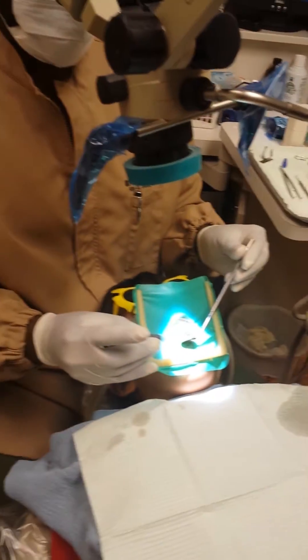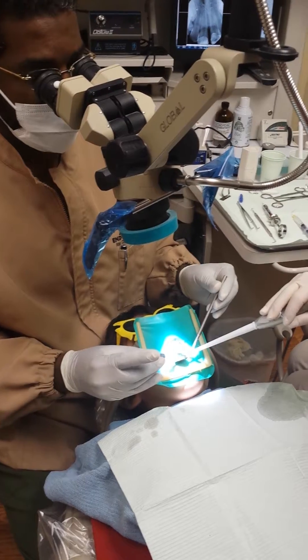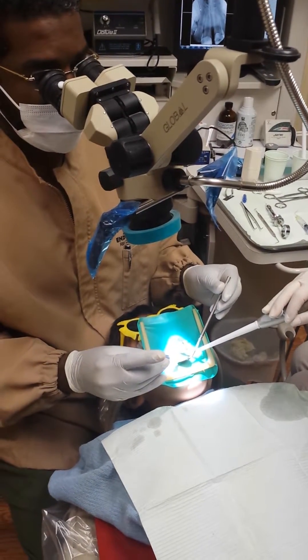Now we're going to rinse it with a little saline, just to make sure we get all the sodium hypochlorite.